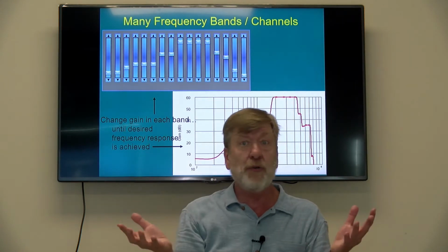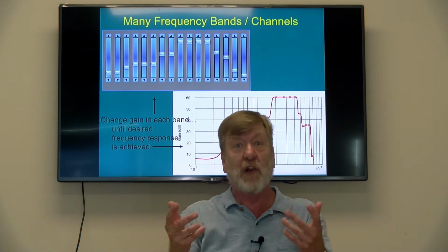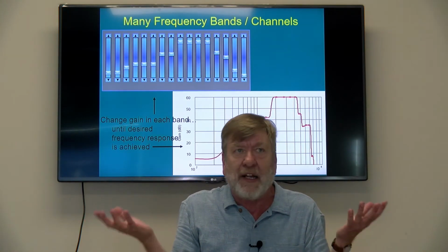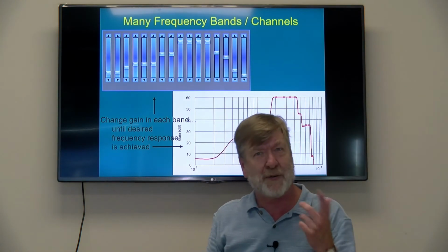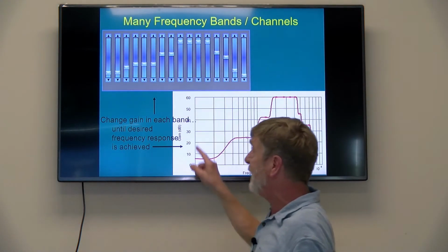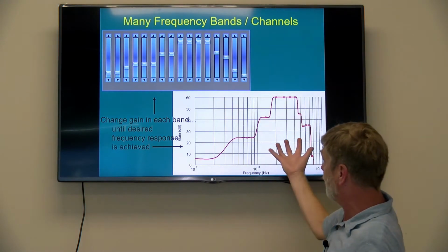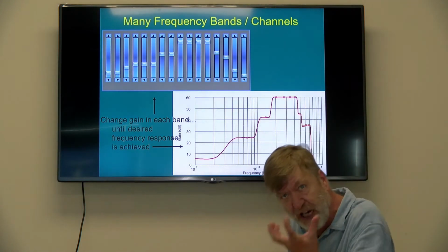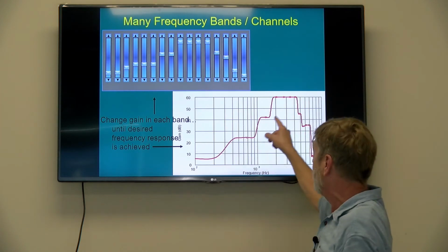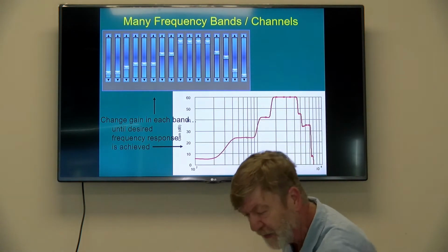So no two hearing losses are identical. Hearing aids take a prescription, just like glasses. I can't wear yours, you can't wear mine. It's the same with hearing aids, and that's what a lot of people don't realize about hearing aids. But we program them really finely so that we can adjust the frequency response, the shape of the gain, the shape of the amplification. We can exquisitely sculpt that because we can divide things up so neatly into different channels.